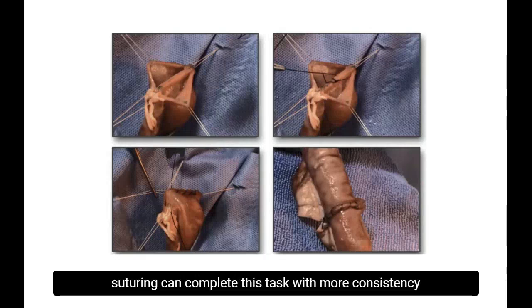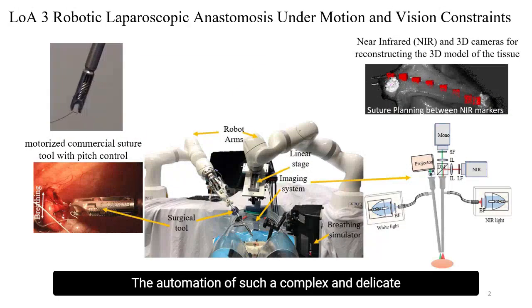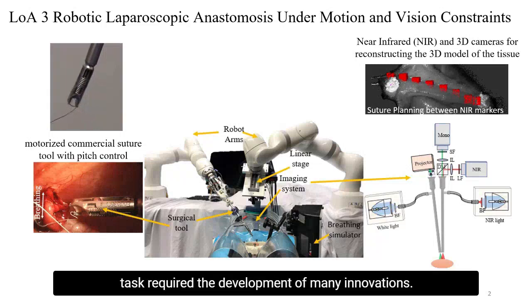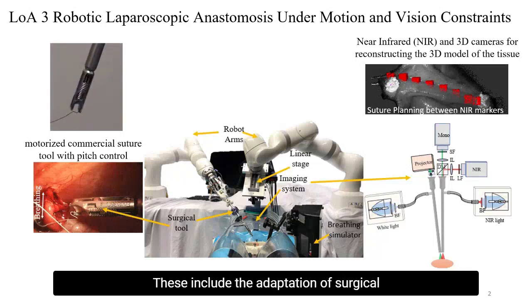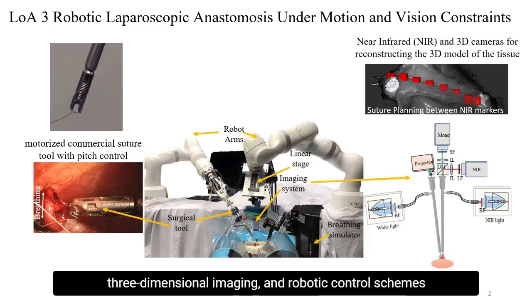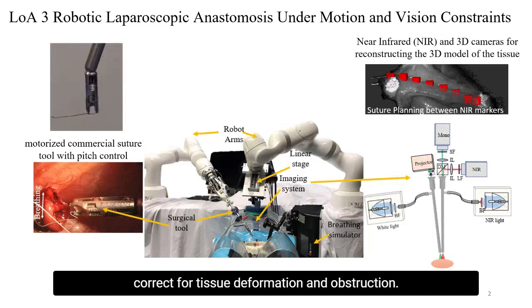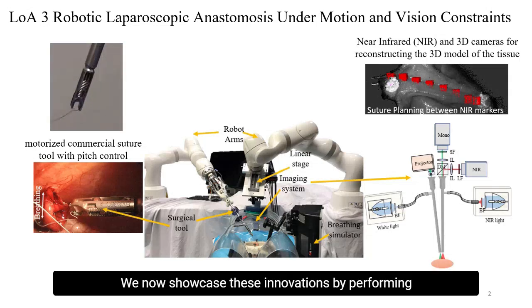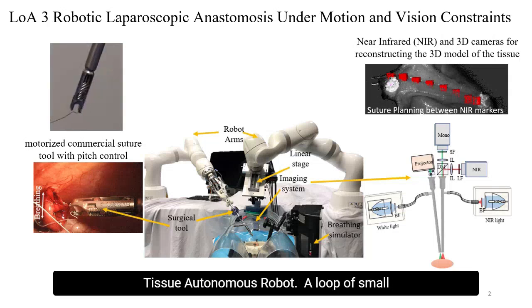Autonomous robotic suturing can complete this task with more consistency and repeatability than that of an expert surgeon. The automation of such a complex and delicate task required the development of many innovations. These include the adaptation of surgical tools to robotic platforms, the combination of near-infrared and structured light cameras for three-dimensional imaging, and robotic control schemes that generate surgical plans to autonomously correct for tissue deformation and obstruction. We now showcase these innovations by performing a small bowel anastomosis using the Smart Tissue Autonomous Robot.